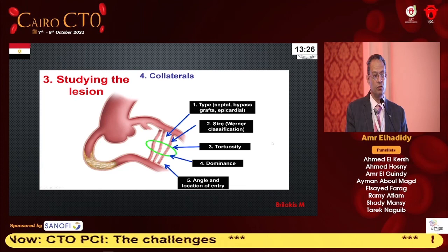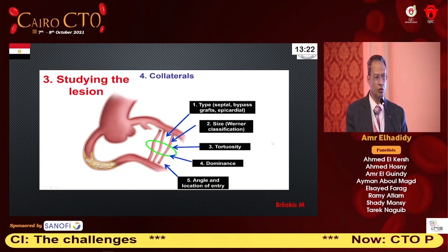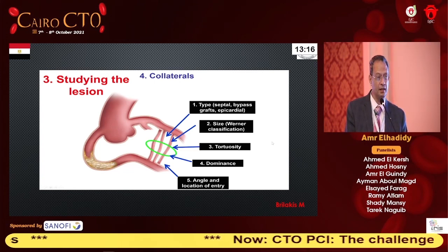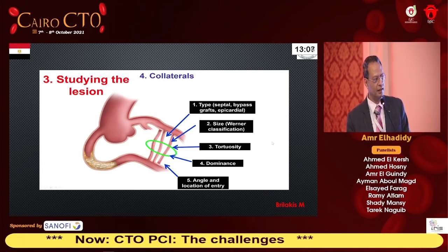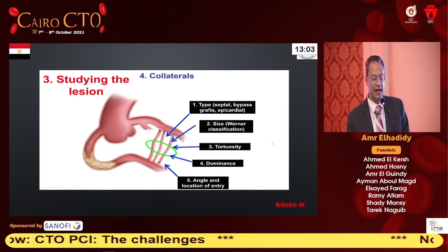As we saw today and yesterday, we worked on some of the septal collaterals, bypass graft as today with Mohannad, live transmission, and also the epicardial one. Definitely the size of these collaterals is very important, whether small or bigger collaterals. Tortuosity, the angle and location of entry.